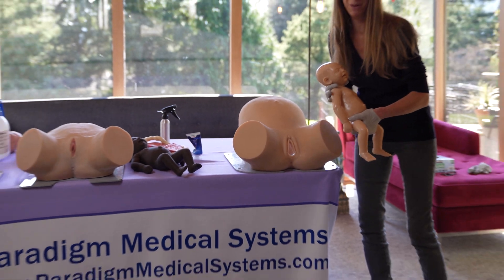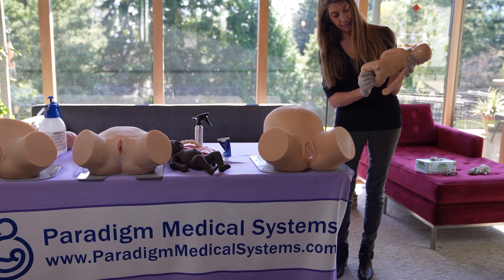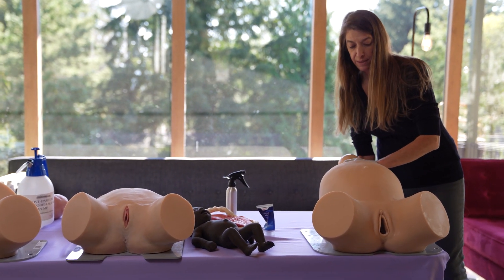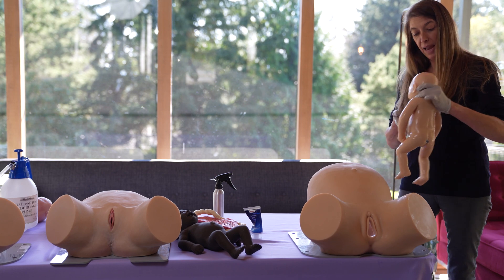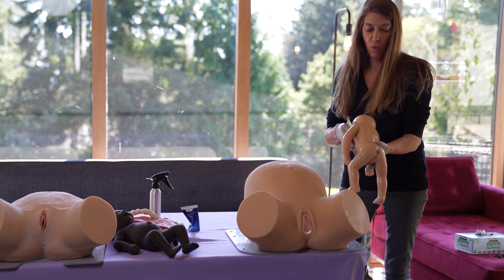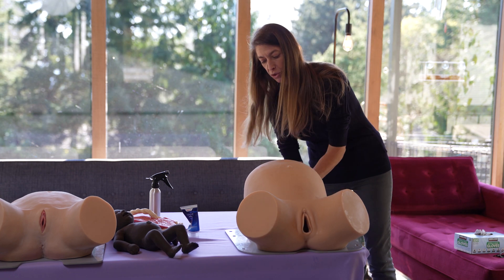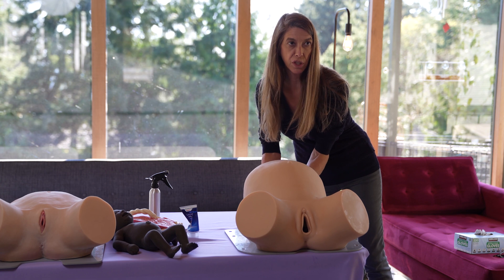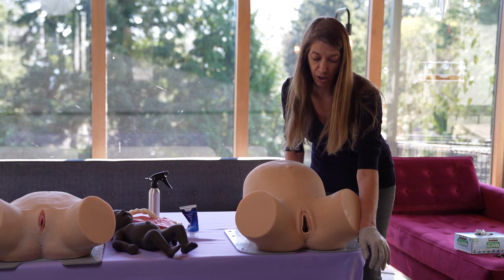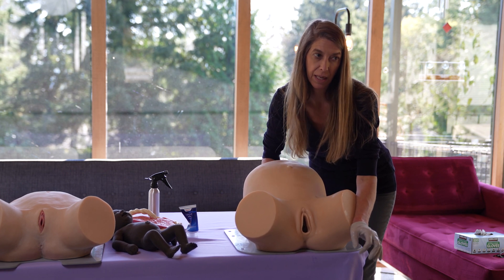I'm not a practitioner — I know that's not how you would hold the baby's neck. For breech delivery, I fold the baby's legs in a little criss-cross and insert her from behind. There are multiple ways to hold from behind when you're delivering. I either put my hand on her stomach with her legs already folded inside and push down that way, or you can push from above as well. I place her legs in a little criss-cross and insert her, and I don't worry about her arms at first — once she's in position I put them across in front of her body, unless I'm intentionally doing nuchal arms.